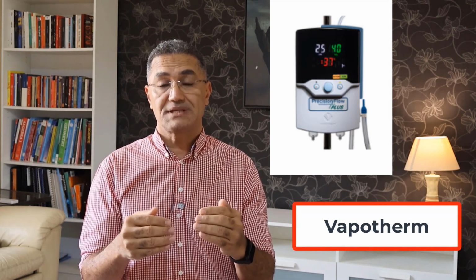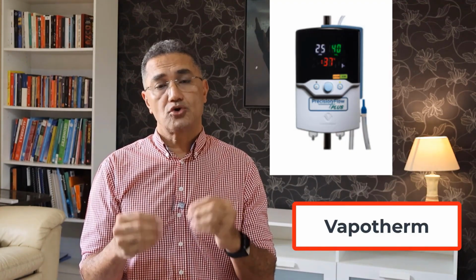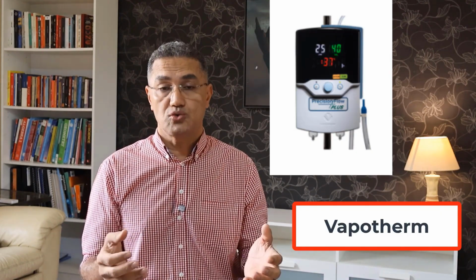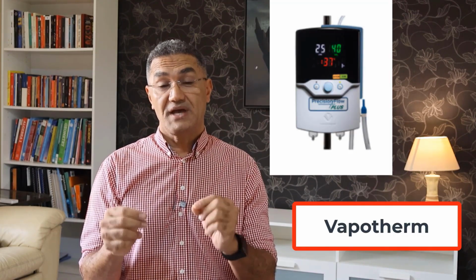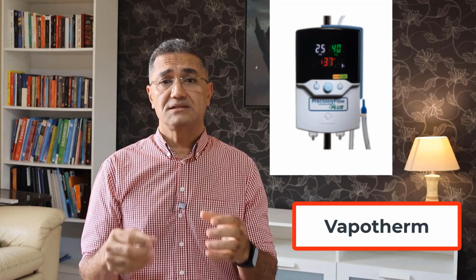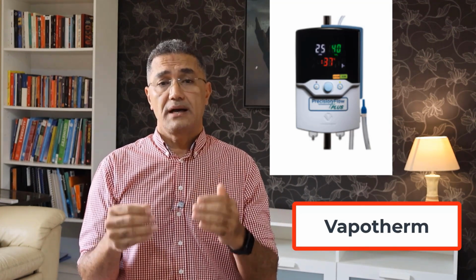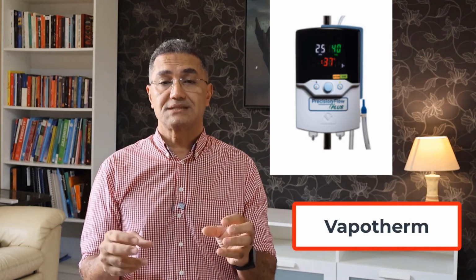By being able to control the humidity and temperature, the system helps ensure that patients remain comfortable and safe during their treatment, especially when they depend on it for extended durations. For example, we can give a patient a nasal cannula flow for a week or even months. So it's essential that we use a machine with this capability, one that works well and has good features, making it worth using. A flow of 5, 6, 7, or 8 for these problems.